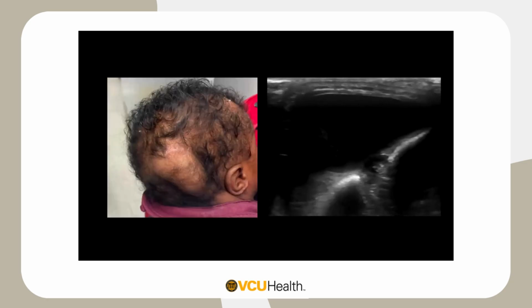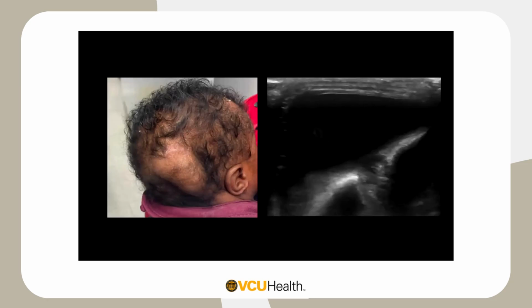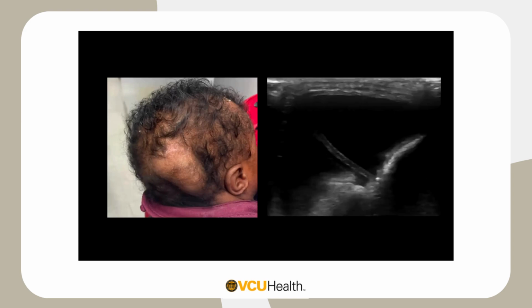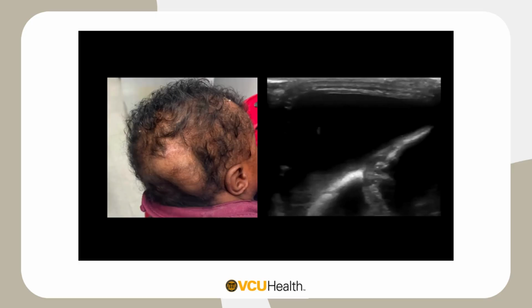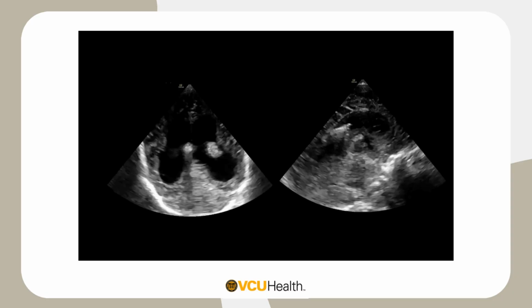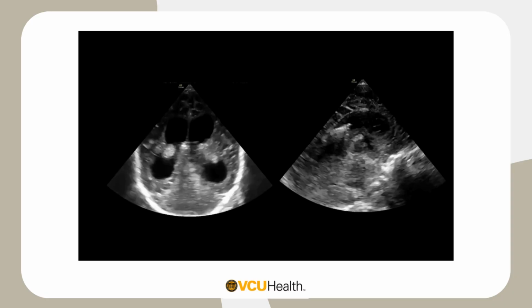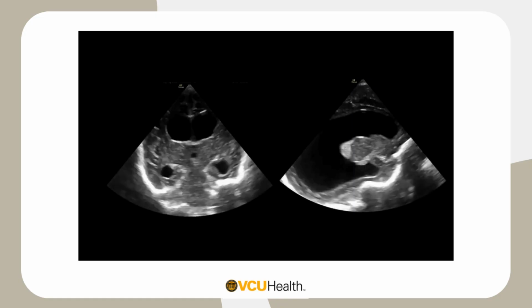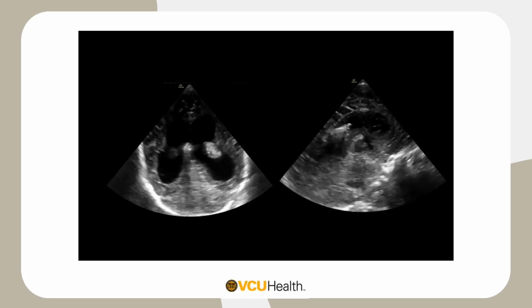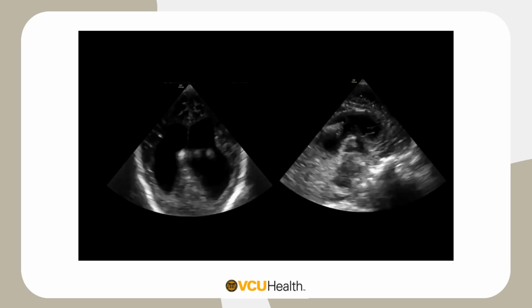So this patient actually has swelling from an old shunt that has been collecting the fluids, a pseudomeningocele. And so there's another shunt that was placed, but it was just having increased swelling. So we wanted to see what was indicated. So as you can see here, there's a shunt in this patient with the bogginess. And here's her intracranial ultrasound that you see here. And then you can actually even see the shunt on the lateral portion of this. And so we were able to trace which shunt was actually the culprit.